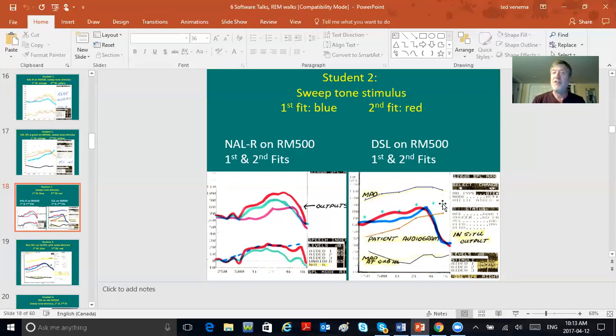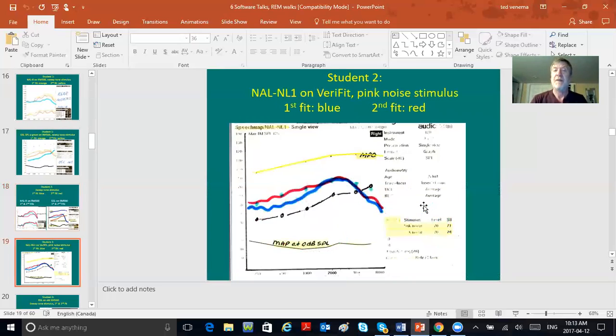Manufacturer software says, ooh, that's a nice fit, perfect match. Take the client, do real ear, enter the audiogram into the real ear system equipment. Choose DSL4 as your fitting method. Hit it, and you find out you are below target. You have to reprogram the hearing aid to hit target.